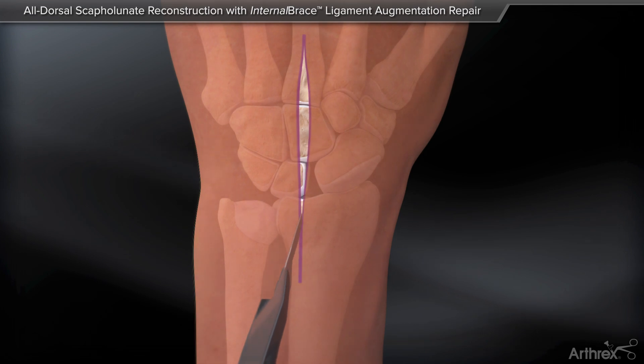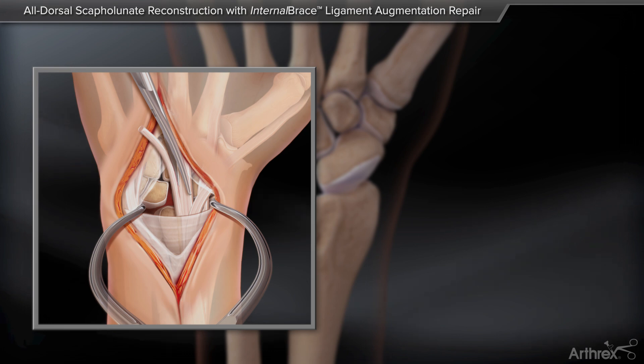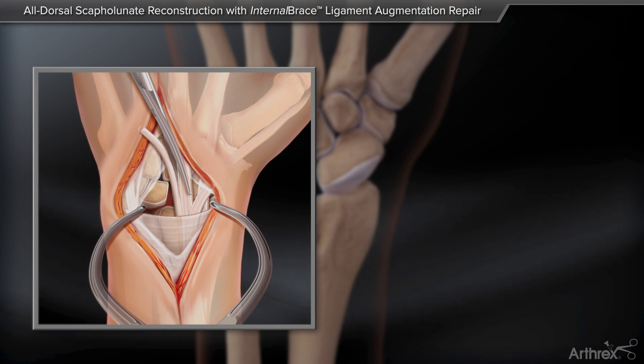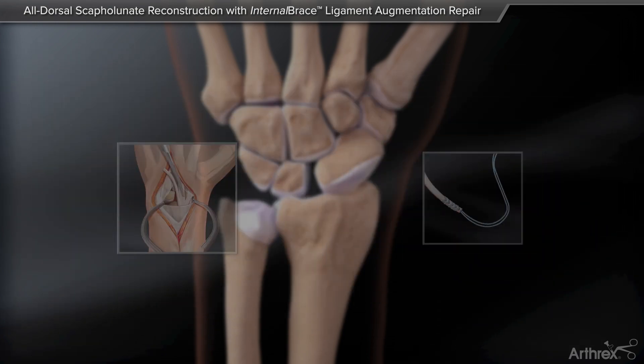Expose the scapholunate joint with a standard dorsal approach. Harvest a 2 mm slip of the extensor carpi radialis brevis (ECRB) tendon at its insertion on the base of the third metacarpal. Whip stitch the end of the graft with a 2-0 fiber loop suture.